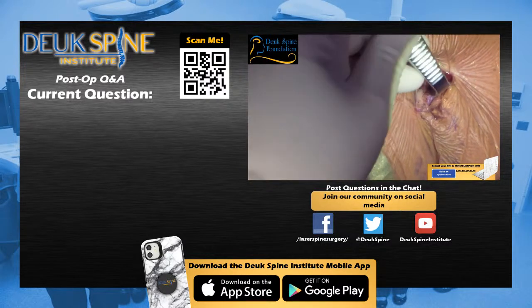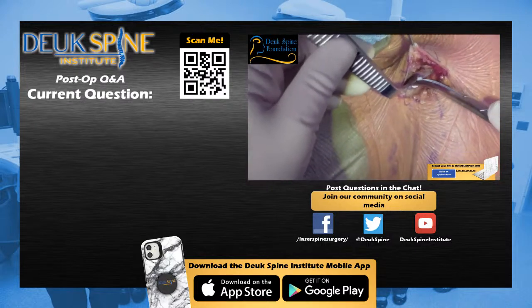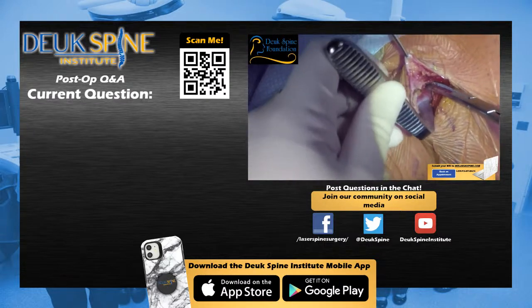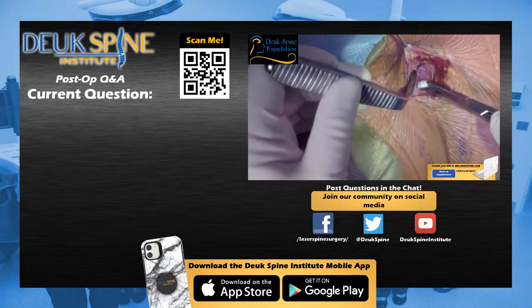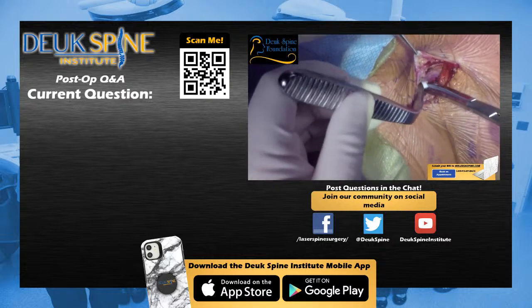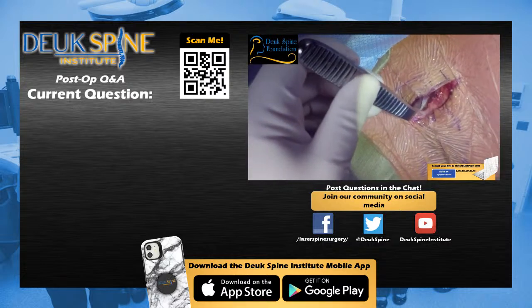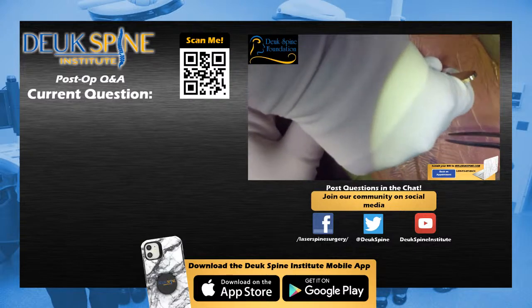Obviously, many years ago, before there was good hemostasis, and hemostasis is very important to be able to do a surgery like this. So hemostasis means to stop the bleeding from the blood vessels. Obviously, if I didn't have gel foam and thrombin, bipolars, a Bovie, those are all tools that surgeons use, modern day tools that really are very, very successful strategies at stopping bleeding or preventing excessive bleeding. And so we lost for this whole surgery 8 milliliters of blood, which is nothing.